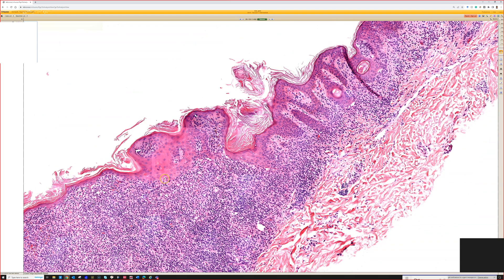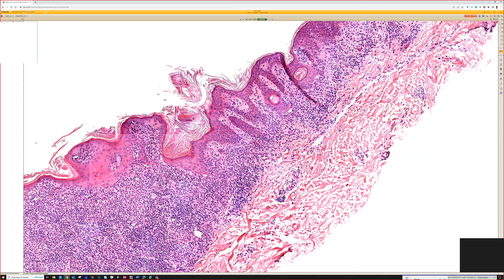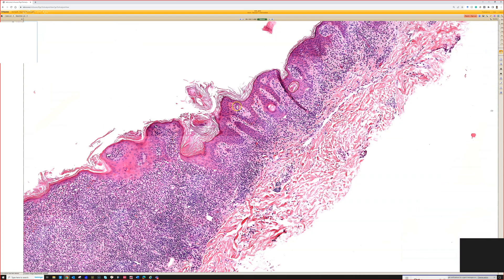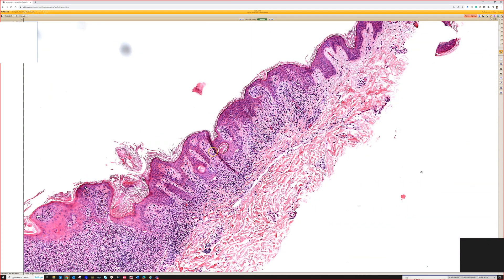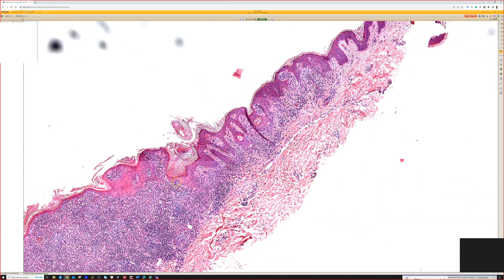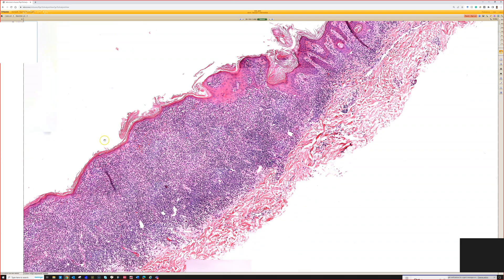We usually see these in kids, teenagers, or young adults. In teaching we call this halo nevus. I do get more worried in an older patient if I see a lot of inflammation in a melanocytic lesion — it doesn't necessarily mean it's malignant, but it means I'm going to stop and look closer. In younger people, this is pretty common.